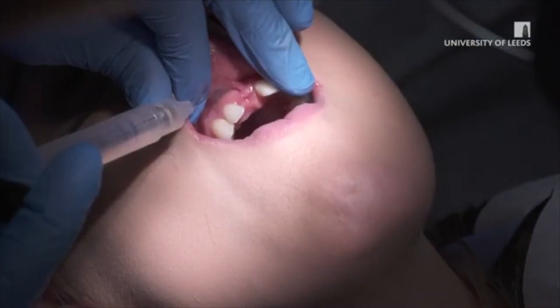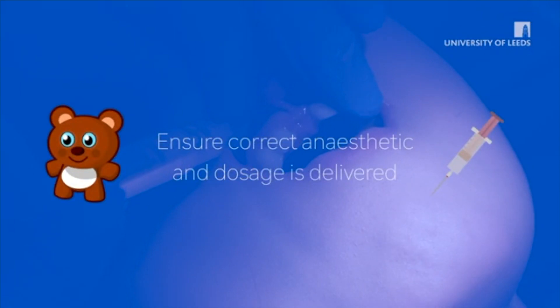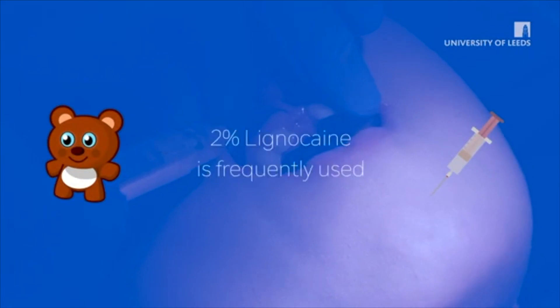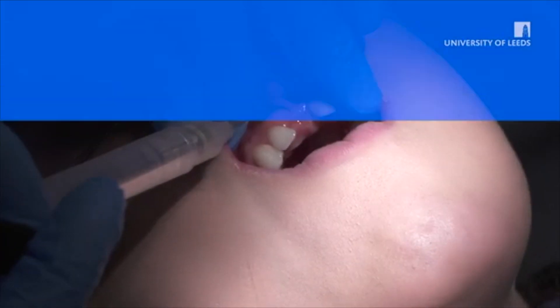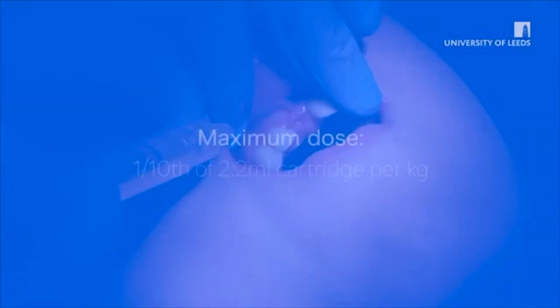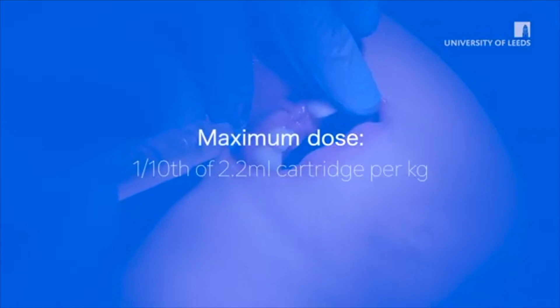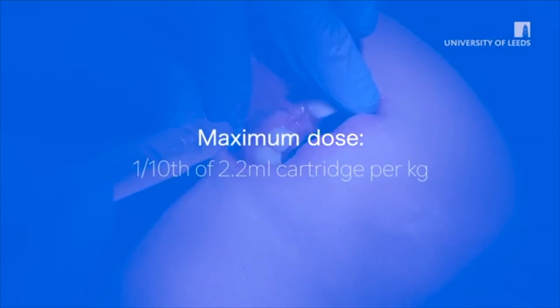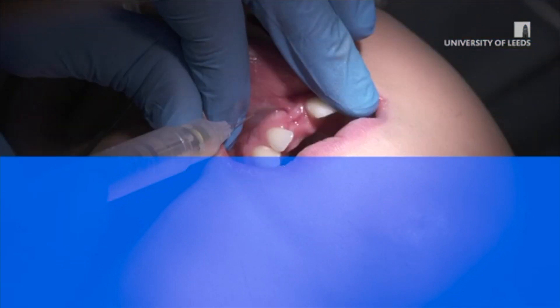Slowly deposit the anesthetic beginning superficially, injecting only into the soft tissues. Make sure to aspirate to avoid injecting into a blood vessel, and ensure the correct anesthetic and dosage is delivered. 2% lignocaine is frequently used; the maximum dose is one-tenth of a 2.2 ml cartridge per kilogram. For example, in a five-year-old, 4.4 ml is the maximum dose.